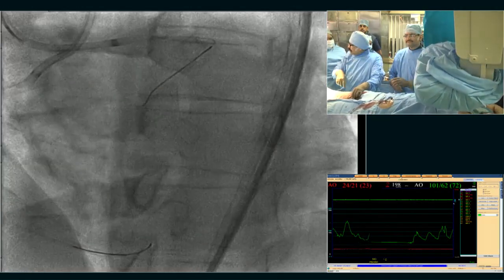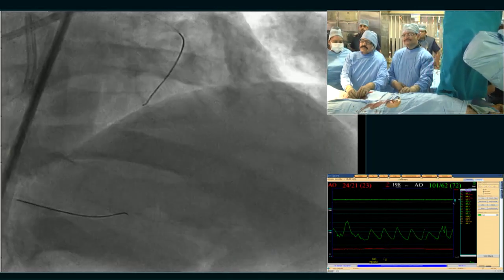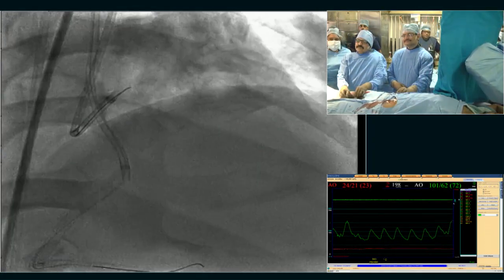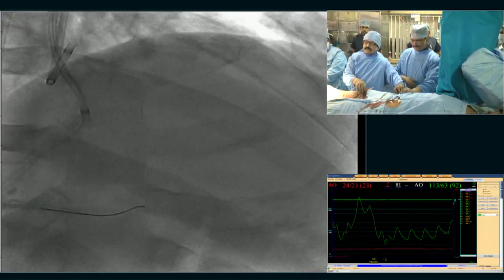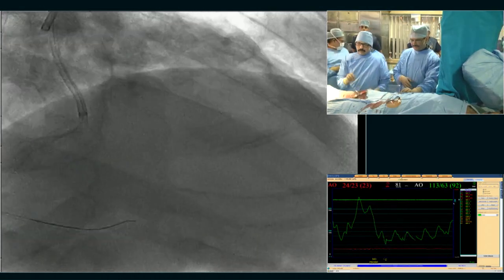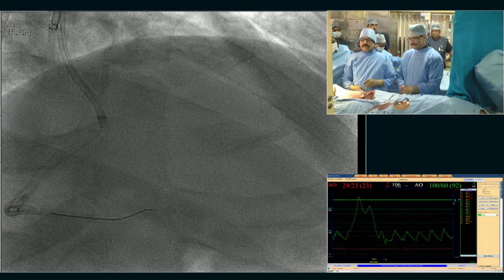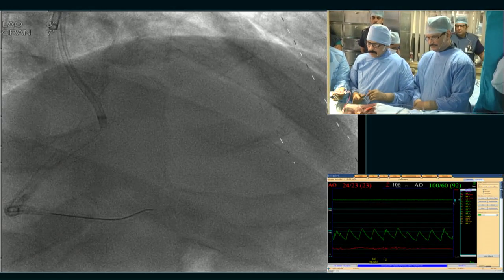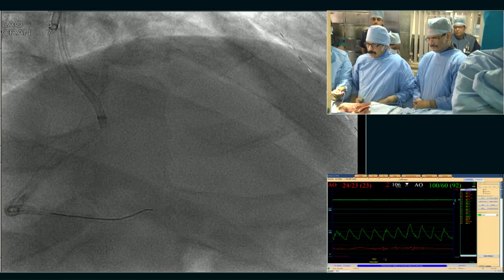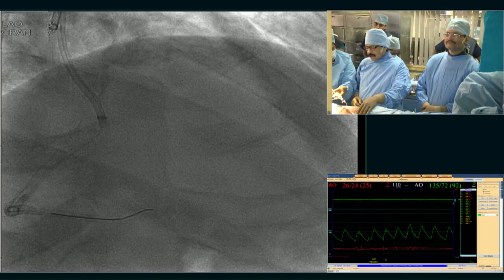Go to the same view, Babu. I am pulling out the left system, which I think is unnecessary. The ACT is maintained above 300 all the time. Okay. So we take a Crusade catheter. Time permits, we'll enter the LAO, please. Crusade with Sion, antegrade.